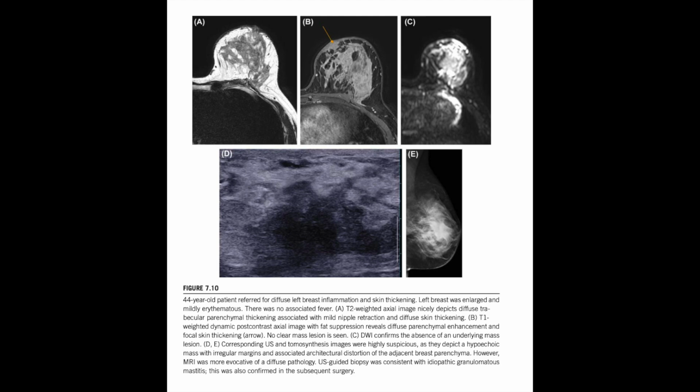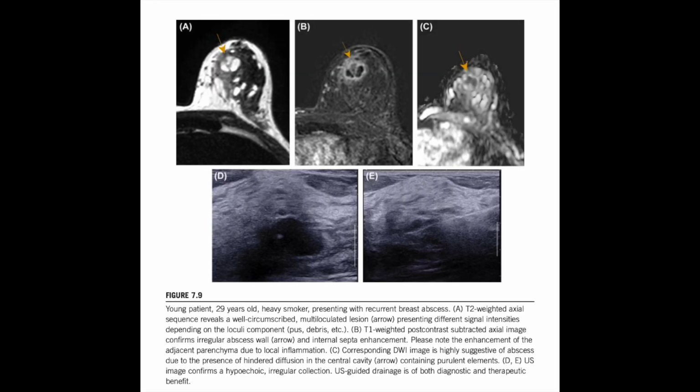Because it's a functional catastrophe. By day 10, the body's biological clock has already switched from the injury phase to the active healing phase. The scar is forming. The scar is forming, that granulation tissue is proliferating, and all those new blood vessels start to light up with intense enhancement that can look identical to a recurrent tumor. So you get a devastating false positive. You get a false positive, which leads to immense patient anxiety and probably another unnecessary biopsy. Sticking to that narrow 1-week window is the best way to avoid it.